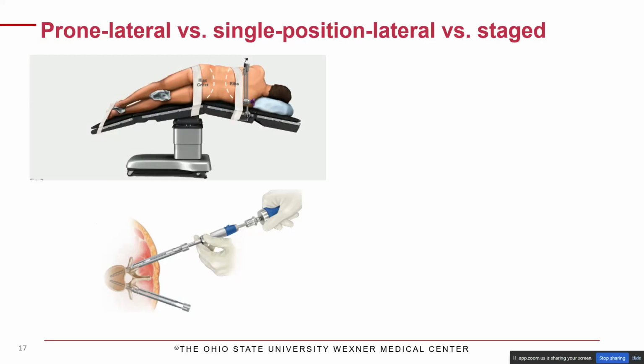One, the spine tends to sink a little bit as the case goes on, and that can lead to a few millimeters of inaccuracy. And if I'm going to have a little bit of inaccuracy, I don't want it with the pedicle screws. The second issue with that is that bottom, the contralateral screw is a real challenge to put in.